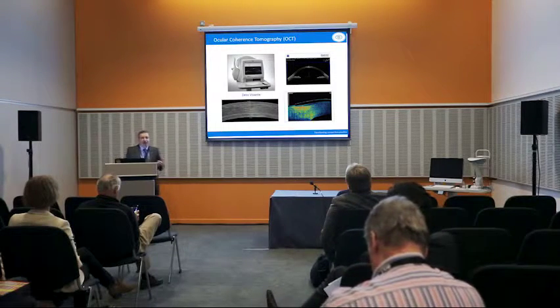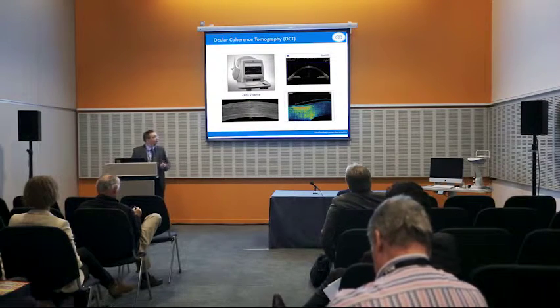Of course, we also have anterior segment OCT, a very useful tool, but for many people very expensive just to have a purely anterior segment OCT. Has anybody got a dedicated ASOCT machine? Yeah, and you're very lucky. Generally, the cost is so high that they're really limited to research establishments and universities. But the Zeiss Visante, which is one of the very few instruments capable of taking the whole width of the cornea, has actually just been discontinued. You're looking at about £50,000 to buy one if you do.